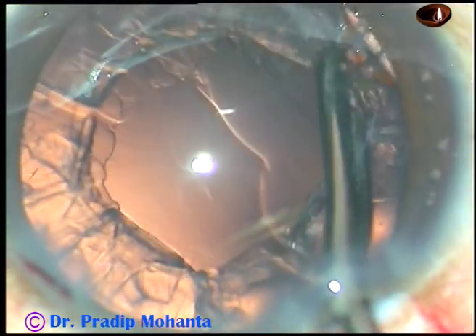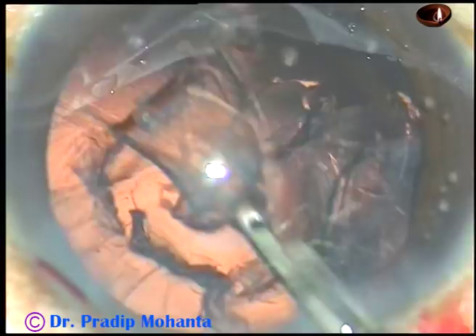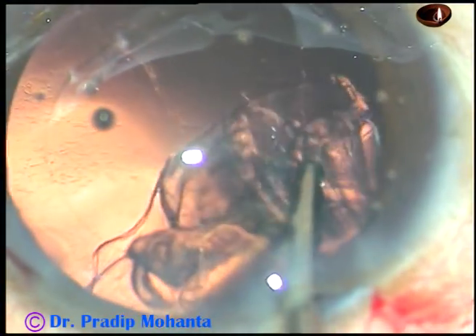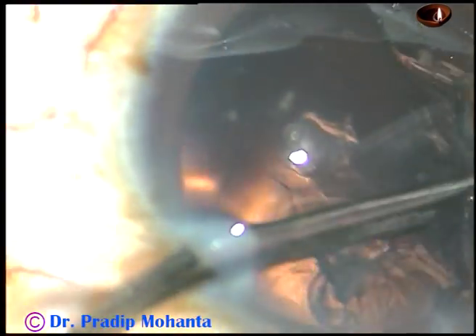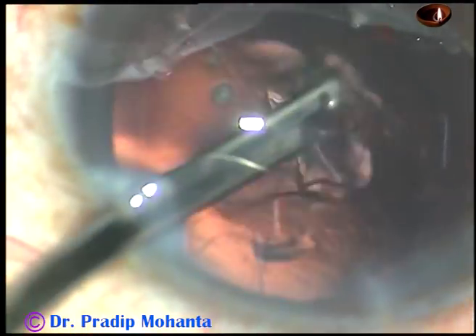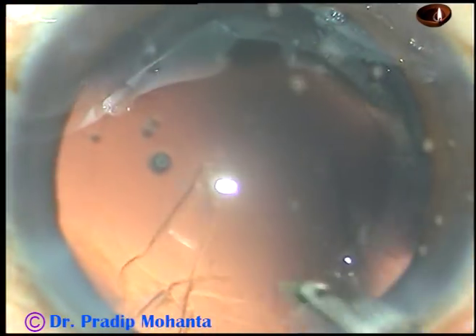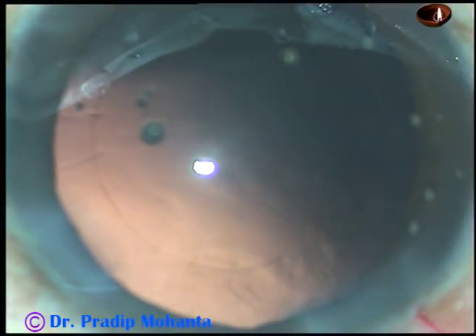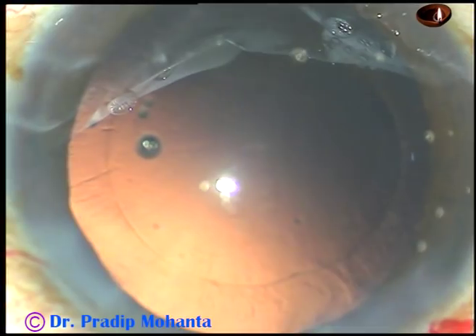Visco is injected and now cortical cleanup is being done. Since there is only one paracentesis, I am using a 23G Simcoe instrument to remove the cortex. The side port is a little larger, about 1.6 mm, but it is about 3 o'clock hours away from the main incision. So whatever astigmatism has been produced by the main incision has been neutralized to some extent by this side port, and there is only one side port.